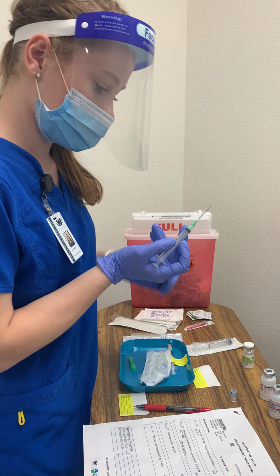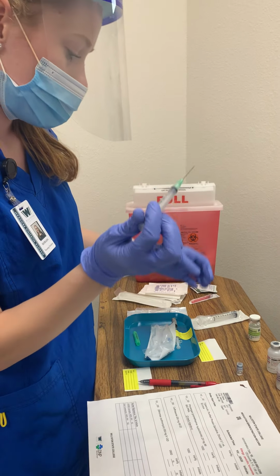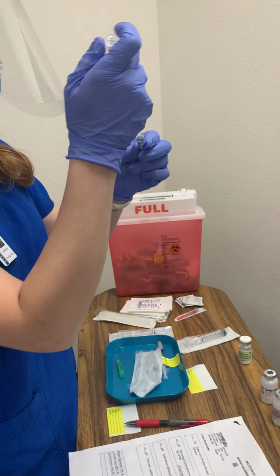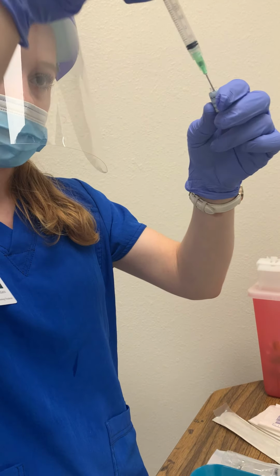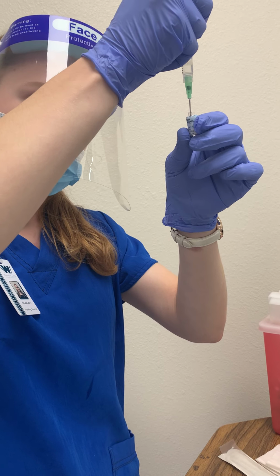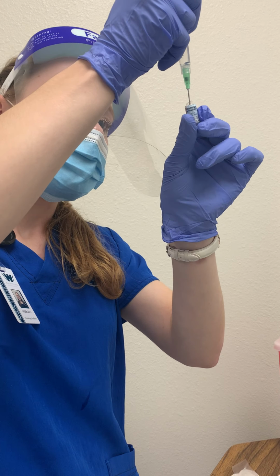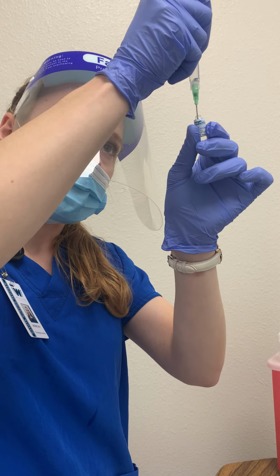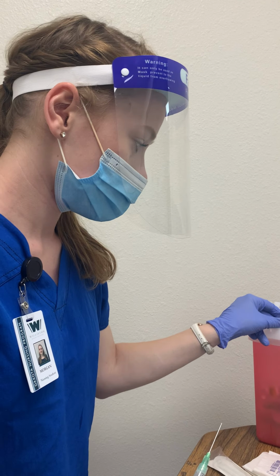And then for this, I don't need to draw up anything. So I'm gonna get my hand ready. Okay, and then I'm gonna make sure not to touch the middle. Okay, perfect. So I got just sucking out the rest of mine. So perfect. And then I'm gonna be putting this in my sharps container.